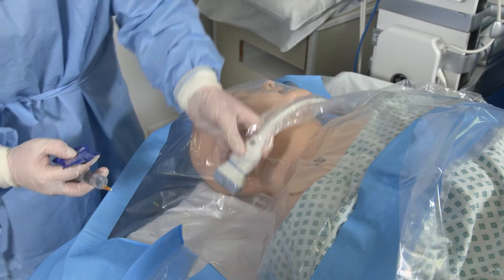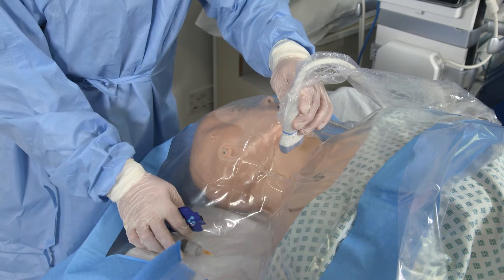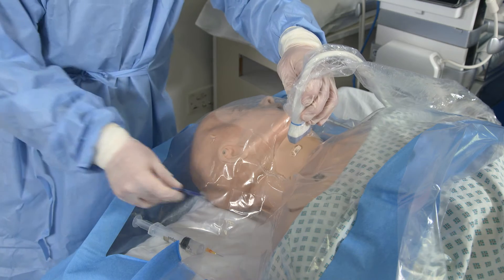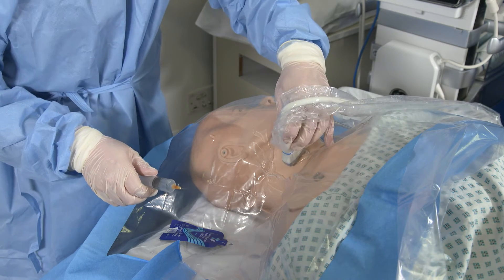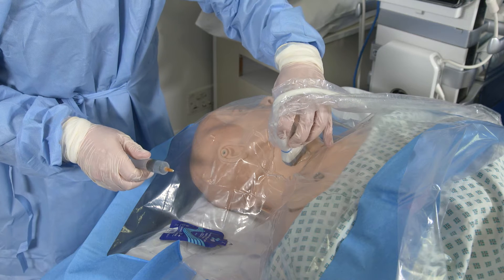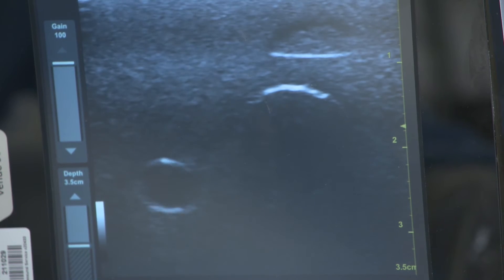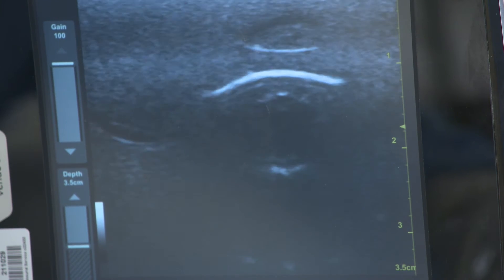Following this, we will use the ultrasound to guide us in anaesthetising the site. Place a small amount of jelly on the patient and then use the probe to find where the internal jugular vein is. On the monitor, you should be able to identify the internal jugular, which is a large circle which should be relatively easily compressible.